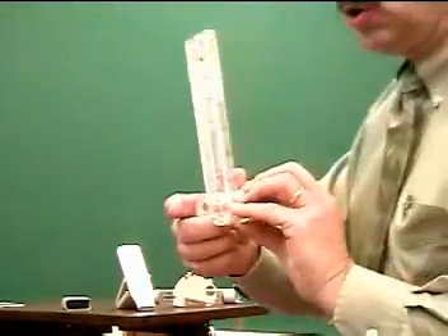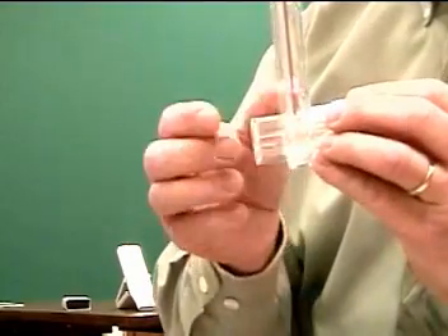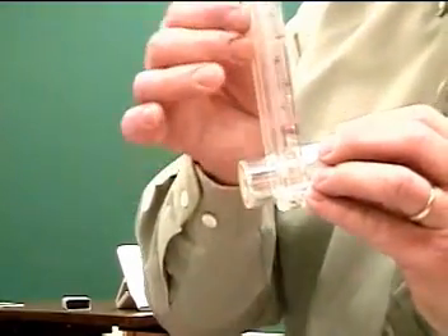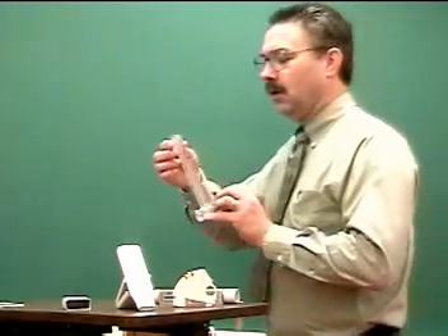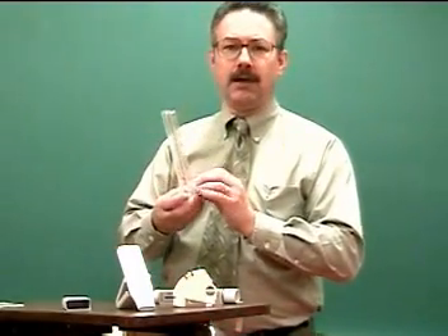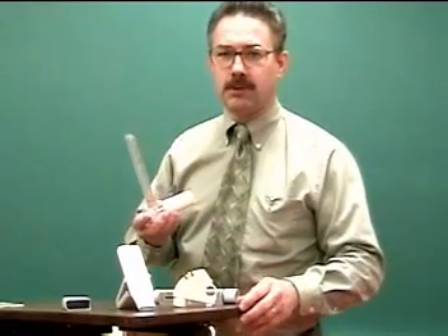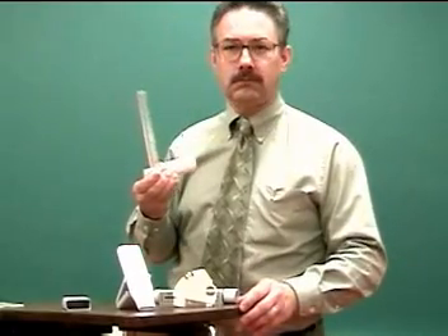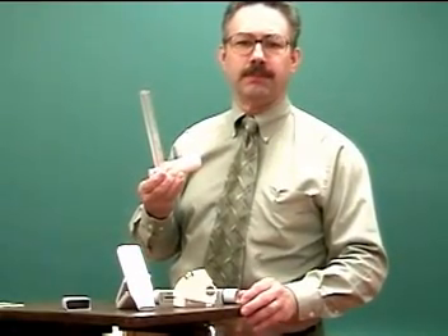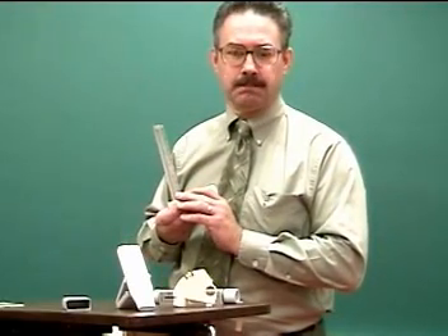It's important that the patient does not restrict the exhalation orifice or any of the valving on the side. Pull the little indicator back down and repeat the same efforts several times. Once you get a good measurement, take the best of the three or four efforts that you did.